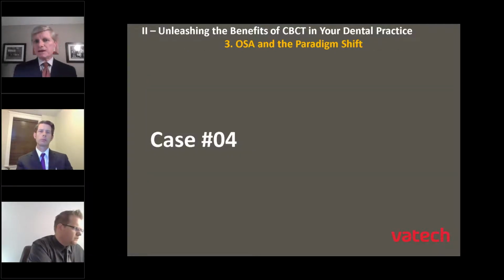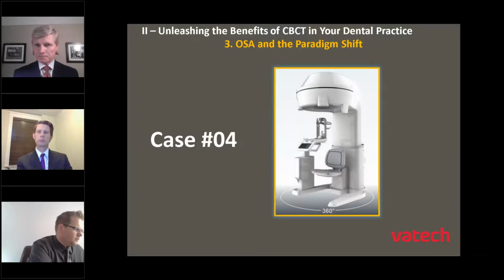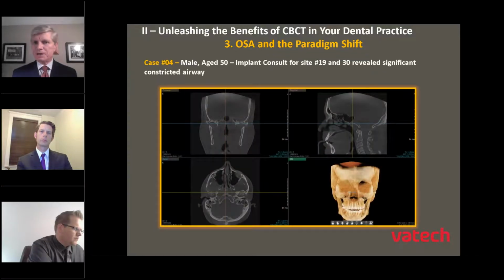Okay, moving on then to case number 4. When we're looking at OSA, what I'm referring to is obstructive sleep apnea, and referring to what's called a paradigm shift. I'll talk about that a little bit later in terms of this particular case. In this particular situation, this was a 21/19 field of view that was captured with our premium device. And again, this was a patient that came in for an implant consult for sites numbers 19 and 30.